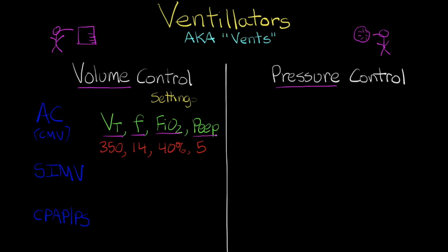that you're giving. So, let's say your patient is beginning to deteriorate and not doing well, based on where your settings are, it gives you an idea of how much more room you have to go up in the current mode that you're at. As well, on the opposite end, if you're working to wean down and eventually get your patient off the ventilator, it gives you an idea of how much more room you have to go down to get to a minimal level of support in order to begin that next step in working towards extubating this patient.